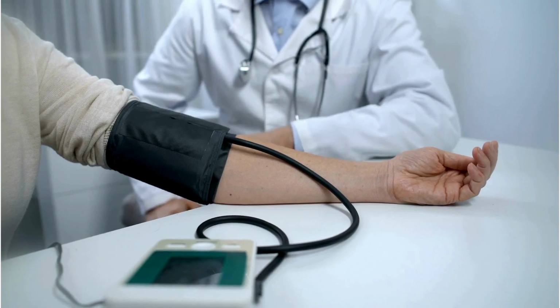Studies show that triphasic waveforms are a strong predictor of normal ABI values, while monophasic waveforms often correlate with ABIs of less than 0.5, which suggests severe arterial disease. Now, if you're not familiar with ABI, that's okay. ABI stands for Ankle Brachial Index. It's a quick, non-invasive test that compares the blood pressure at the ankle to the blood pressure in the arm. If the pressure at the ankle is lower, that tells us there may be reduced blood flow to the legs and feet, which means wounds in those areas may not heal well without help.